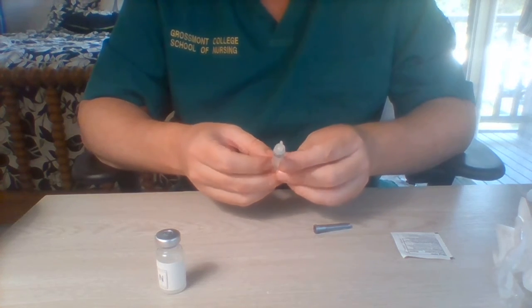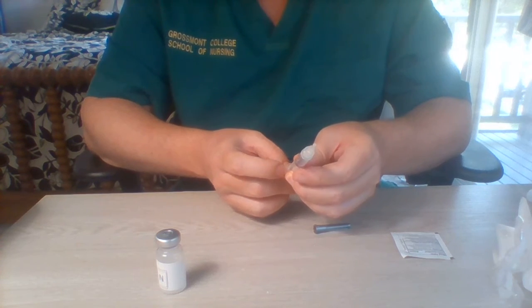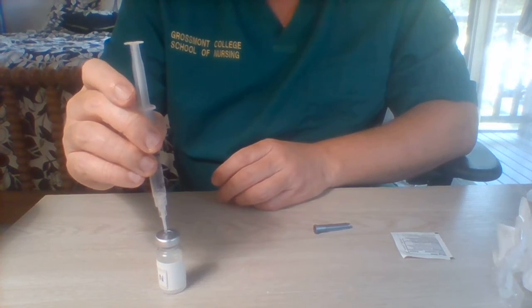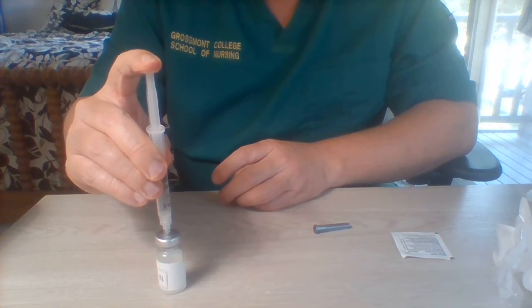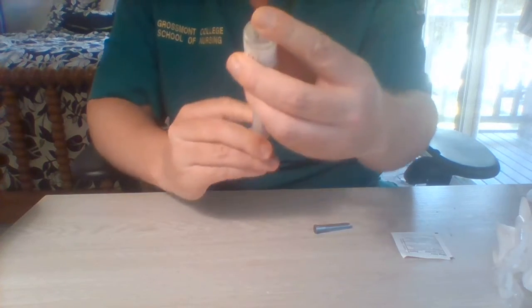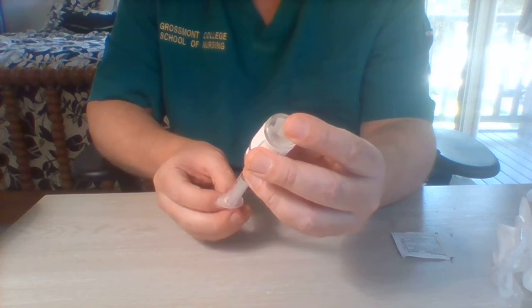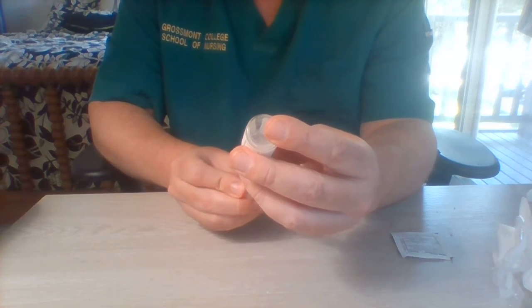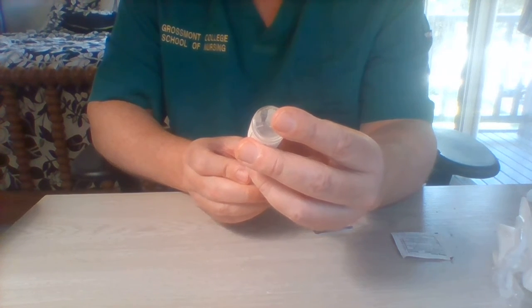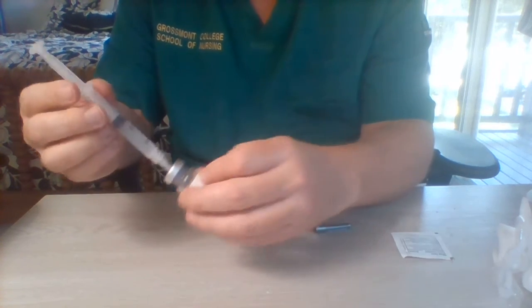I take the cap off and leave that ready. So we're getting 2 milliliters. So I need to pull 2 milliliters of air in the syringe, inject it into the vial, and then draw 2 milliliters of medication without getting any air bubbles. All right, we're at 2 milliliters.